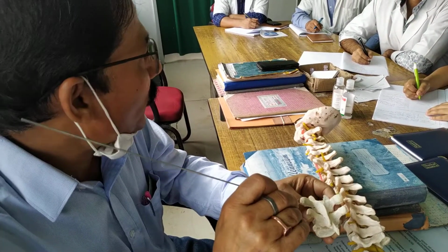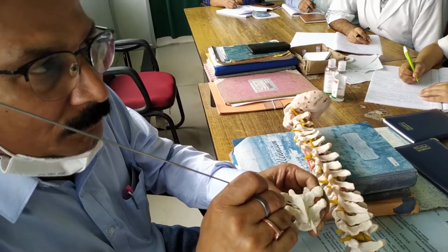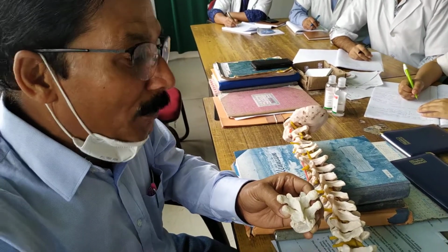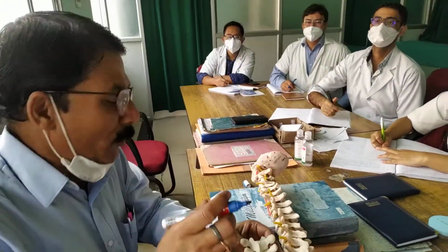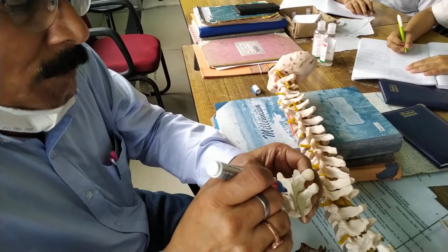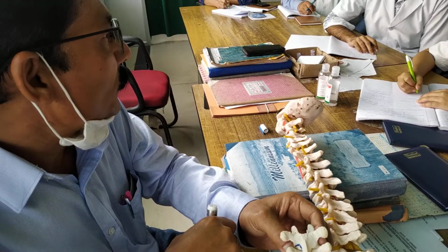So this is the inferior articular surface of the vertebra above, and this is your transverse process. Now this is the area of interest for us. What you need to do, many times, is nibble this area. Sometimes you can take a bone rongeur or a nibbler to cut this part away. Most of the time some surgeons also do an osteotomy to cut this part away. Once you cut this part away, you will find your articular surface here.